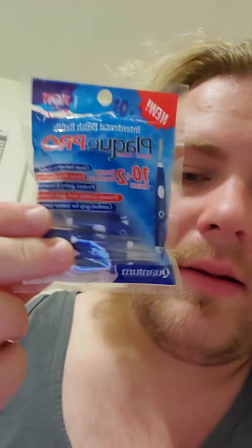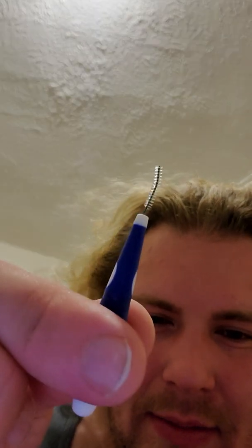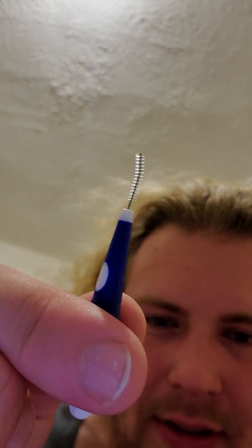After that, I use a Plaque Pro. It looks like this. It's kind of like a pipe cleaner, but it's half the size. They're really, really good. And you take this off. There's the little pipe cleaner. See if I can get that. Come on. There we go.